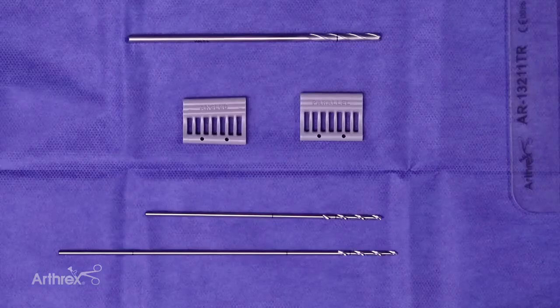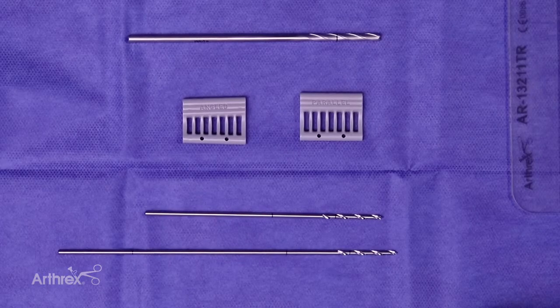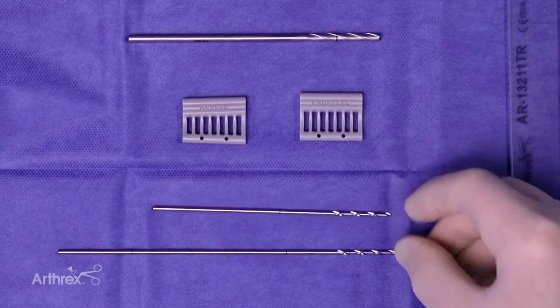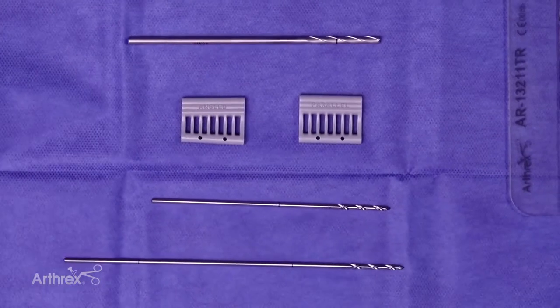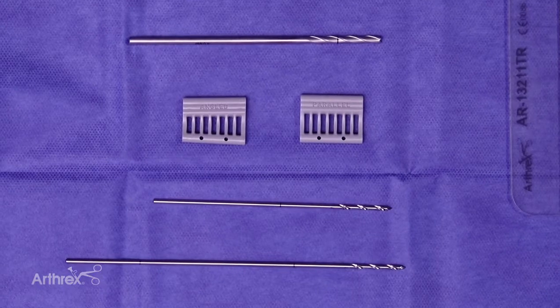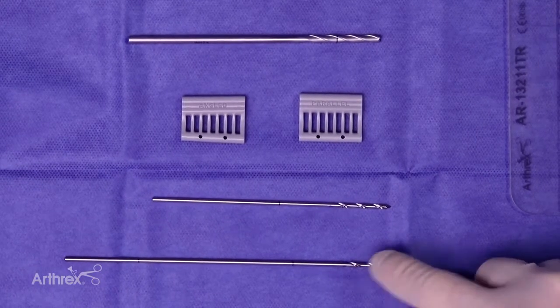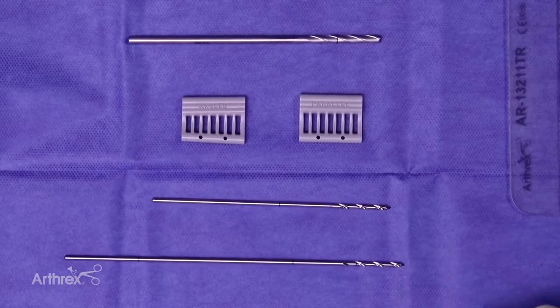The nice thing about the bit configuration is there's two lengths. Before, when you'd put your bits in, they would be hard to drill the second one because the length of the first one would get in your way. This way you drill the shorter one first and then when you drill your larger one you're not going to hit the end of that bit as you put your second one in. They're marked for the appropriate depth with a laser line for drilling for the 3.9 Biocomposite Swivlock.